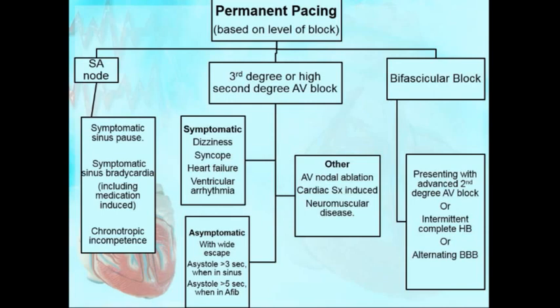Symptomatic sinus bradycardia and symptomatic AV block. The key word is symptomatic. They will give you somebody whose heart rate is 48 and he's a tennis player with no issues; don't do anything, okay? The big word is symptomatic sinus bradycardia. What it means is that if there is an asymptomatic bradycardia patient, you should not be putting in a pacemaker. That's our class 1, class 3.